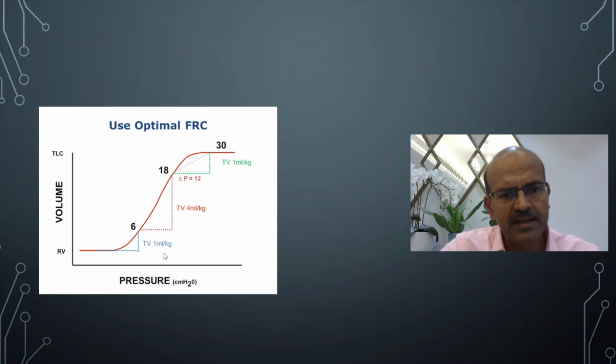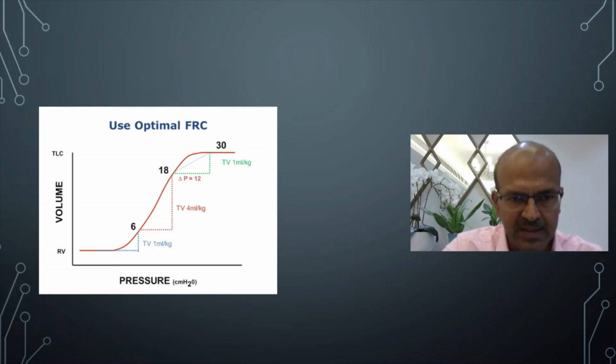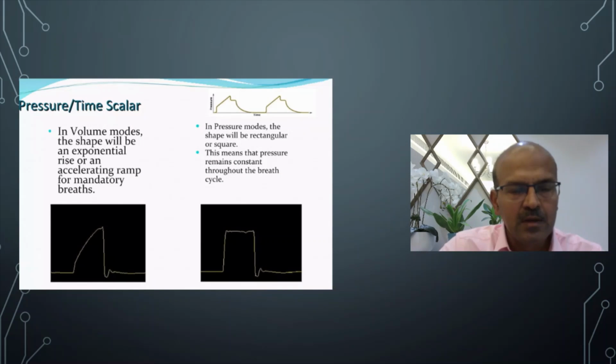And then there is a playlist on ventilation, and I've covered many of these basic terminologies in that. I'll link in the video info for this playlist as well. So now we'll go through each of the loops and the waves.